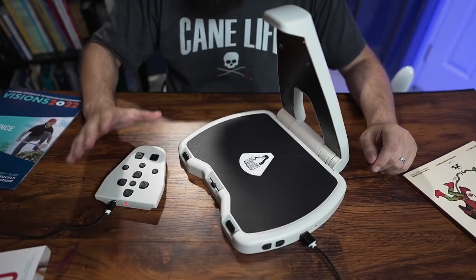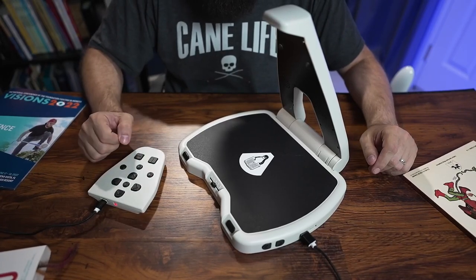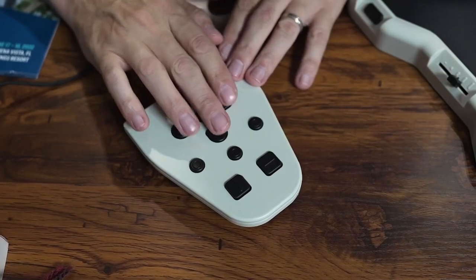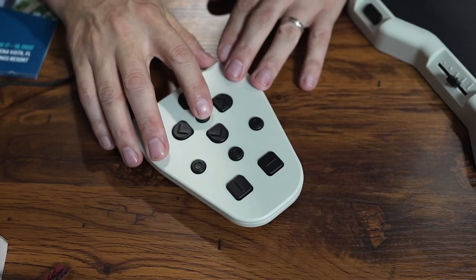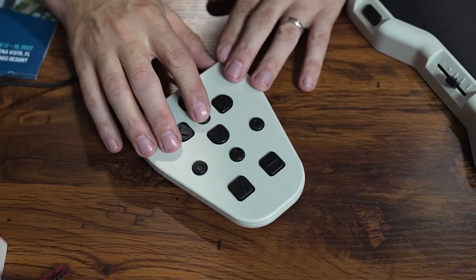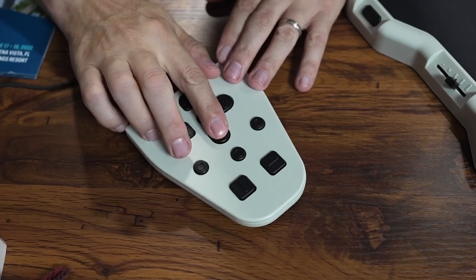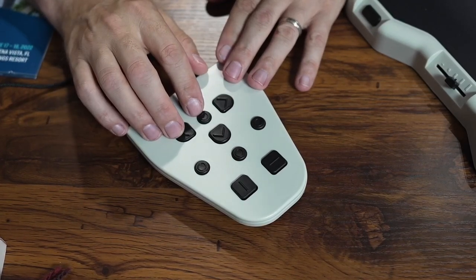We also have the keypad with extra buttons for working with the text. There's a four-way directional pad, and pressing the middle button plays or pauses. With the up and down buttons I can choose how I want to navigate through the document — by paragraph, by sentence, by word, or by character. So I can cycle through those navigation levels using the up and down arrows.